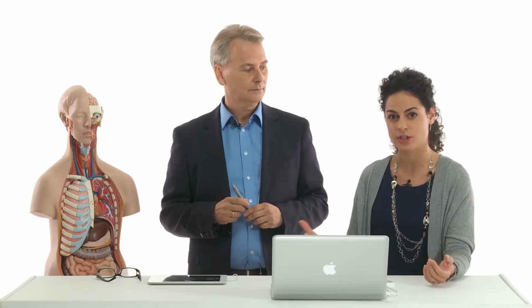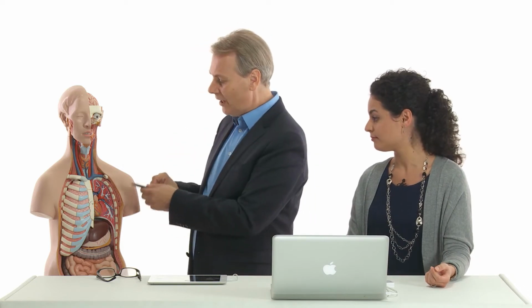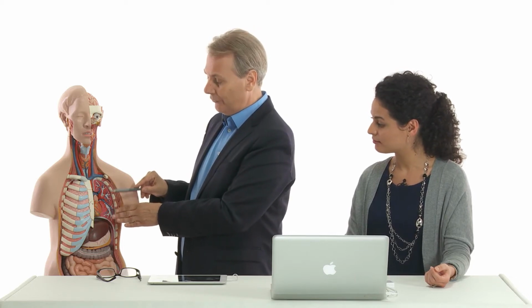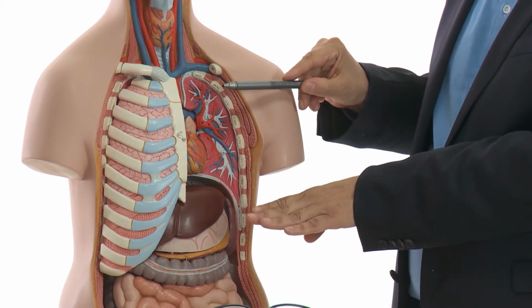Yes, and there's another issue. It's women and breast. And actually, when you want to image a woman, you have to stay just underneath the breast, because usually it's difficult to image through the breast. Right, remember, the breast is not really at the portion of the fifth intercostal space where you image a man. So it's a little bit cranial, so it does not really present an obstacle, as long as you image from underneath the breast.